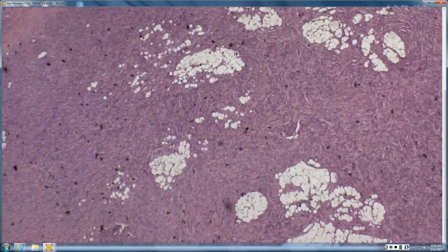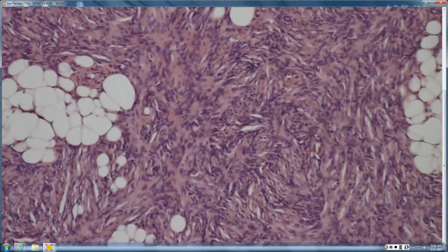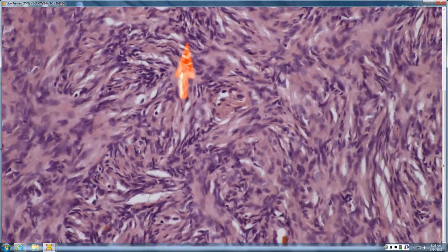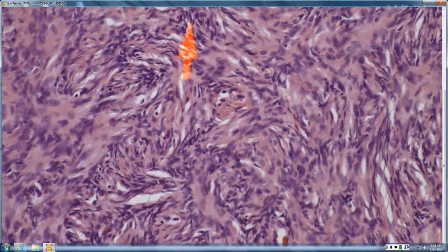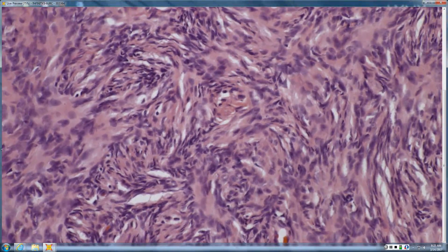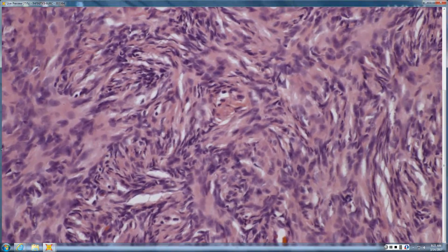So, kind of has like a herringbone type pattern. So herringbone would lead you to conventional fibrosarcoma. In a fibrosarcoma, all the nuclei in the herringbone are equally dark and skinny. Are these all equally dark and skinny, or are they alternating fascicles of skinny and dark and oval and pale? The latter. So the latter, which would be characteristic not for a conventional fibrosarcoma, but for DFSP. I'm sorry, I didn't mean angiosarcoma, I meant fibrosarcoma. Sorry about that. My bad.